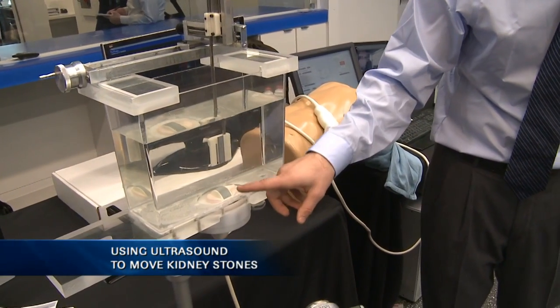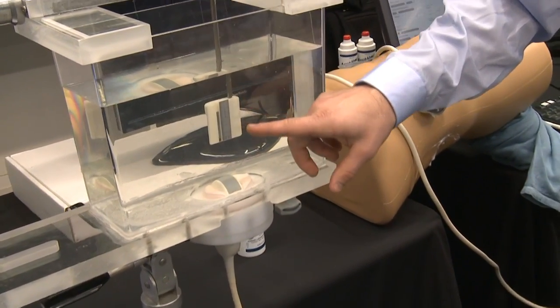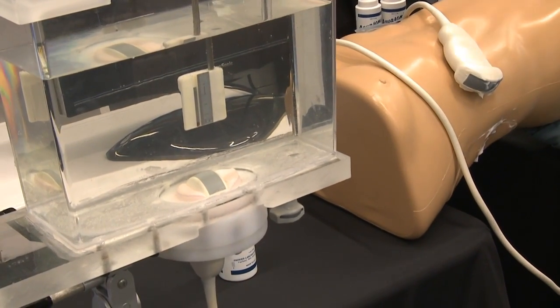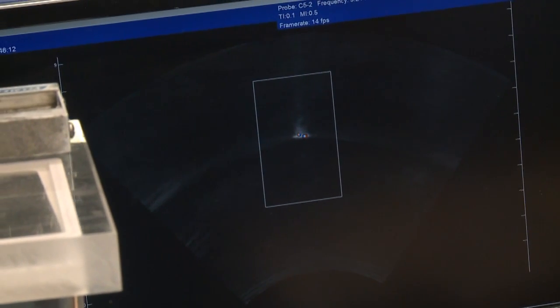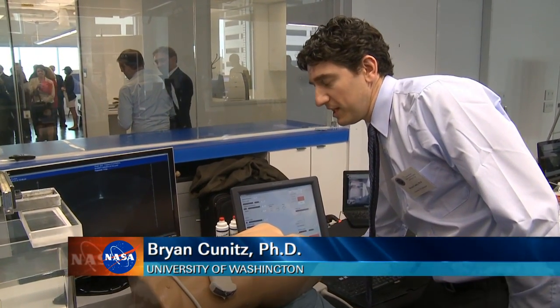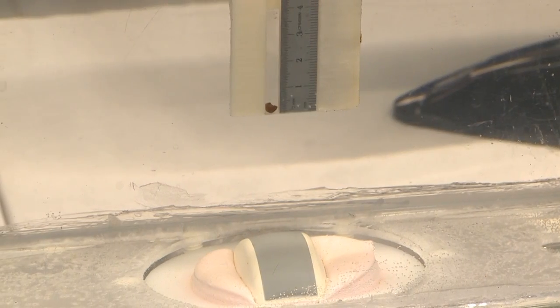We have it just in a tank of water, facing upward. This is a real human kidney stone in this channel right here. The idea of the setup is first we can use our Doppler ultrasound to locate the stone — you can see it shows up as this twinkling pattern. Once you've located the stone, you target on the stone or just behind it, press the foot pedal or button, and the stone will actually move up.